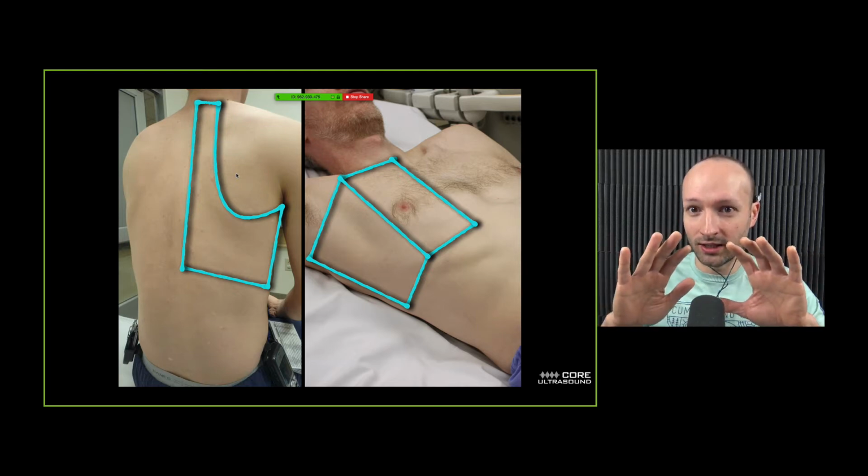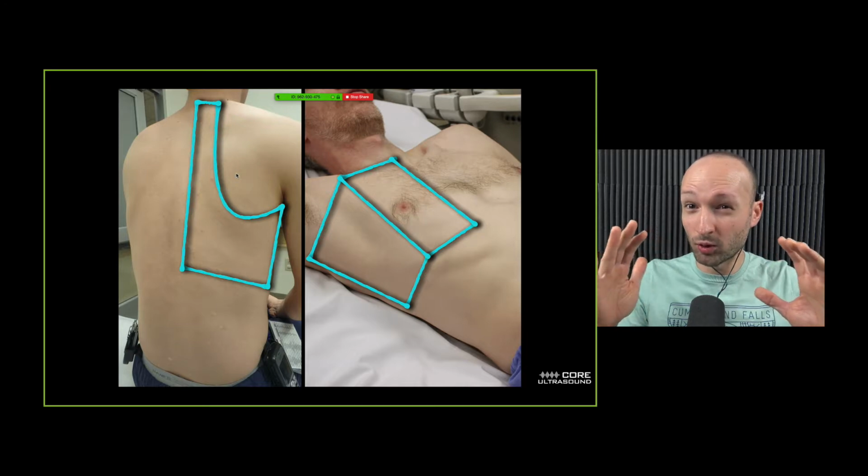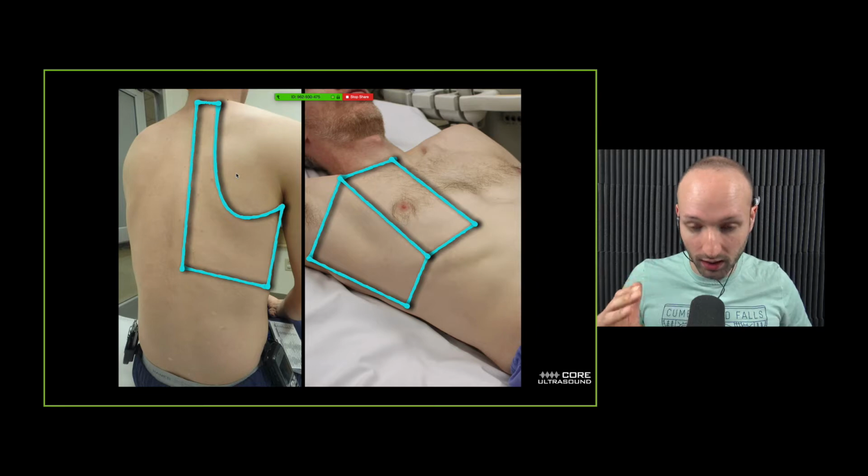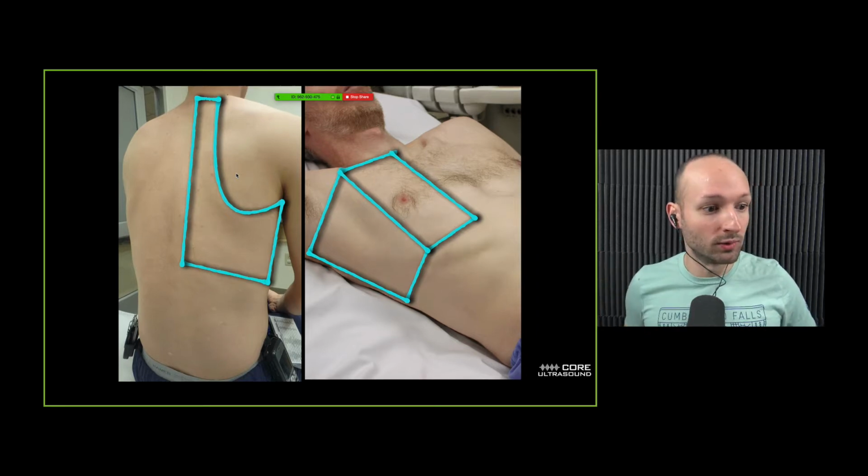And what that does is it actually helps spread the scapula a little more laterally. It might give you a centimeter or two more of the lung to actually look at. So that's something that you can do extra.